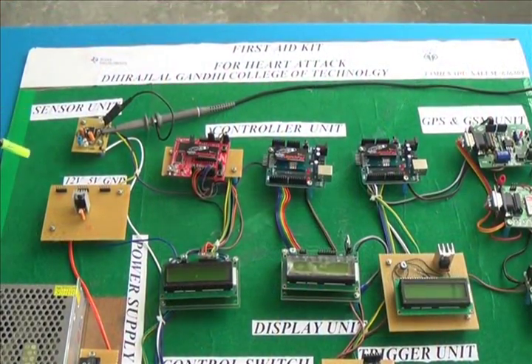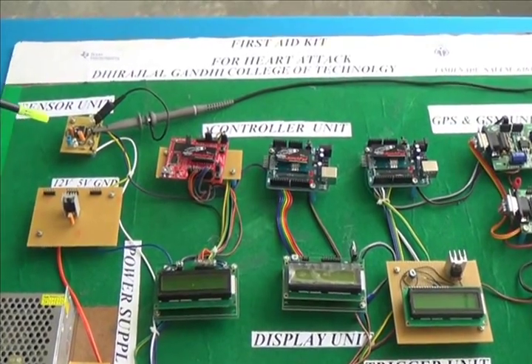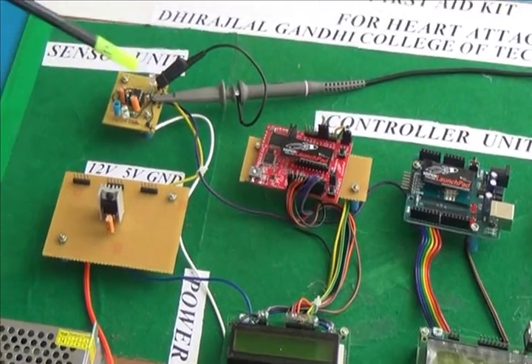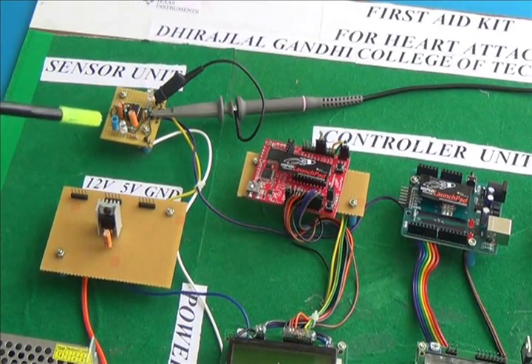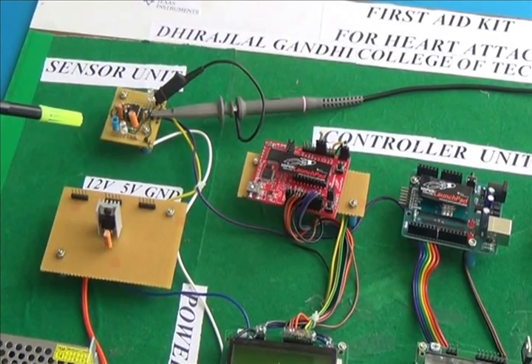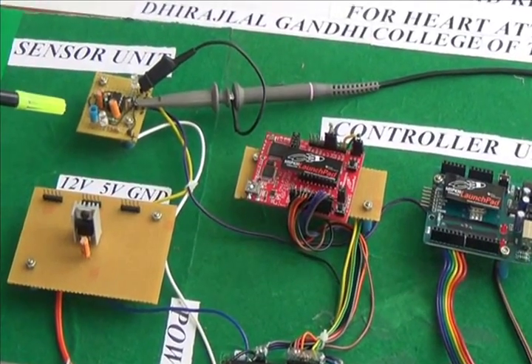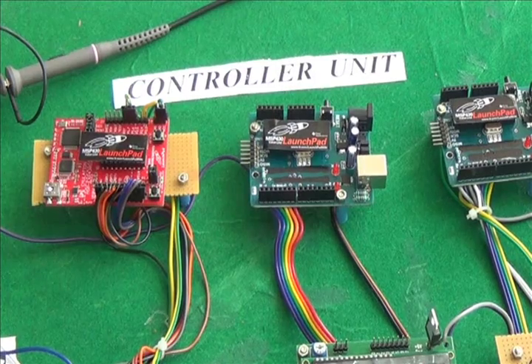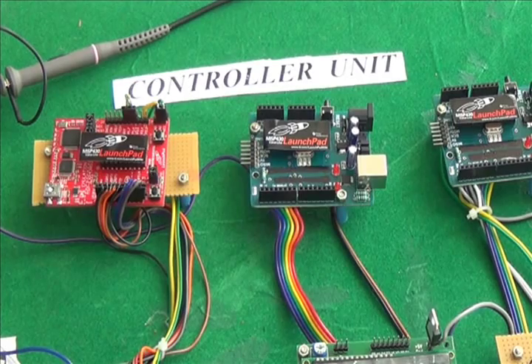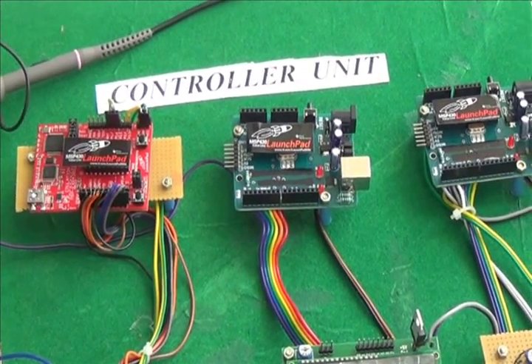Here this is the heartbeat sensor. We are using a TI IC in this heartbeat sensor as an op-amp. This heartbeat sensor reads the human heartbeat from the finger and wrist. This signal is transferred to the controller unit, which consists of 3 controllers with 3 displays for additional support.